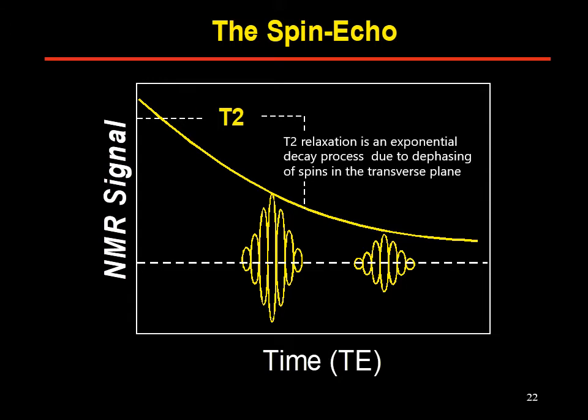In comparing T2 relaxation to T2 star relaxation, T2 relaxation is always a slower process than T2 star relaxation because T2 star relaxation is influenced not only by how these magnetic dipoles, the hydrogen nuclei, affect one another, but also by local inhomogeneities. The spin echo pulse sequence removes the effect of most of these local inhomogeneities, and therefore the decay is slower than with T2 star relaxation.